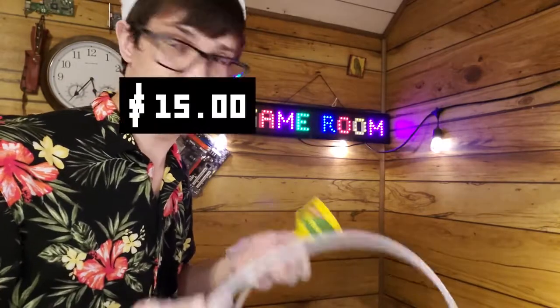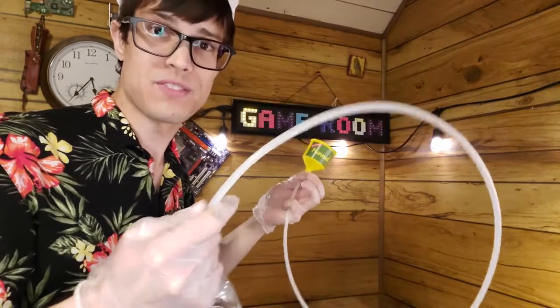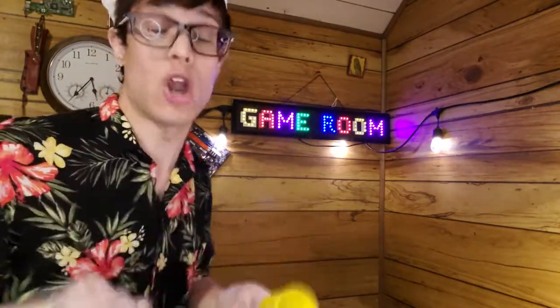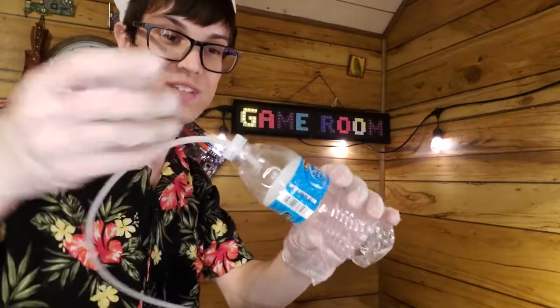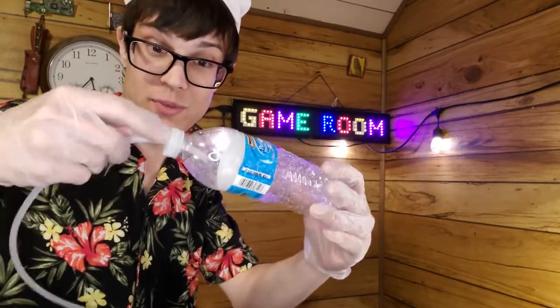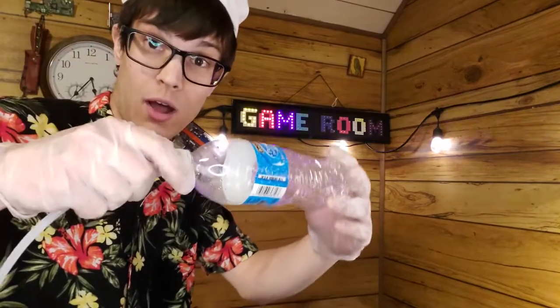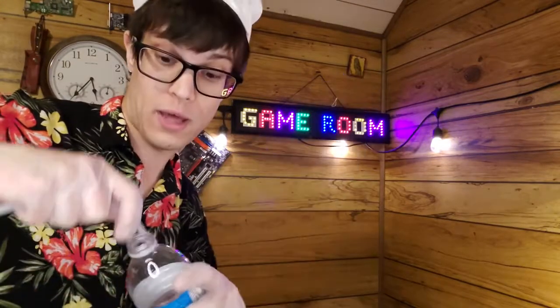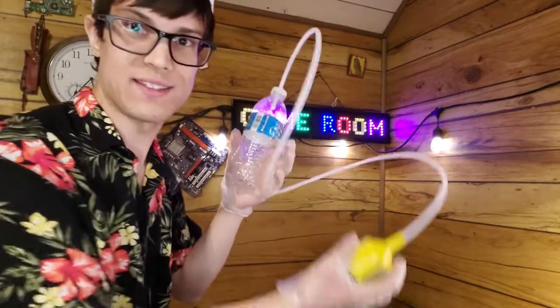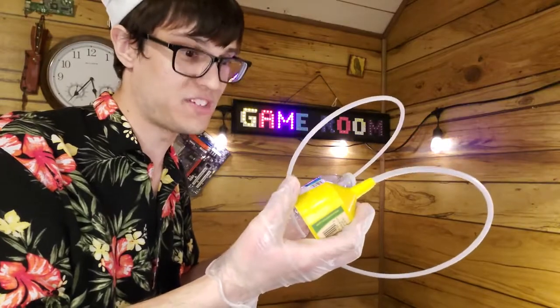You now have a DIY condom-catheter-style collection device. Get some tape, put it around whatever you need. So there you go — a do-it-yourself build for around $50 and maybe an hour of time. Again, this is not medical advice — see the chef's hat, no scrubs. The gloves are for winter itch only. When the bottle is full, you just flip it, stick it into a new water bottle, then take the lid from the new bottle and put it on the old one to seal it. You can throw it away or clean it and reuse it — this is a more sustainable way to reuse water bottles.